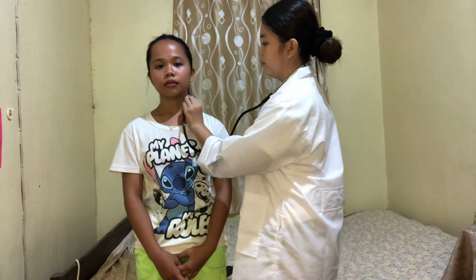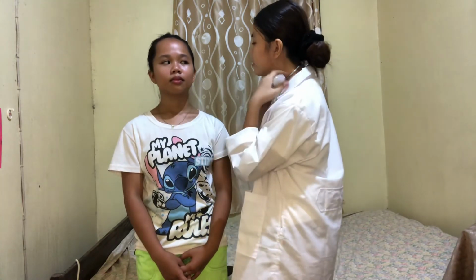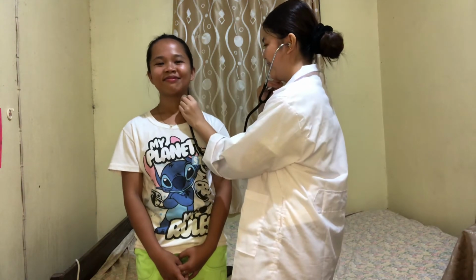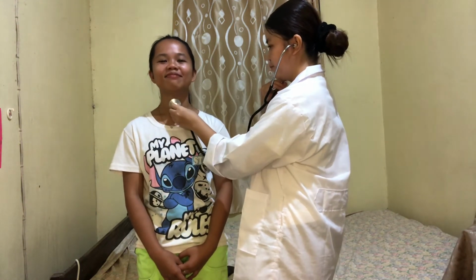Next is we'll auscultate the trachea using this stethoscope. It is to assess the airflow through the airway. Okay, it is just normal.